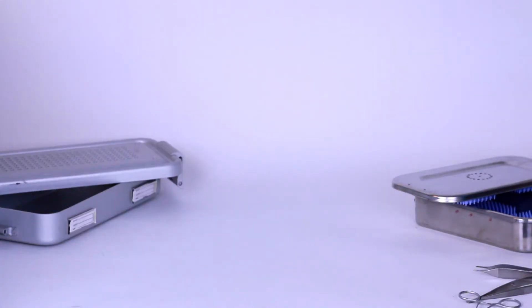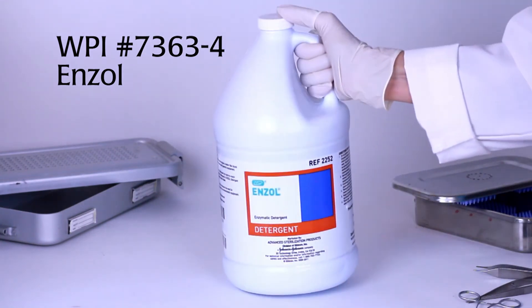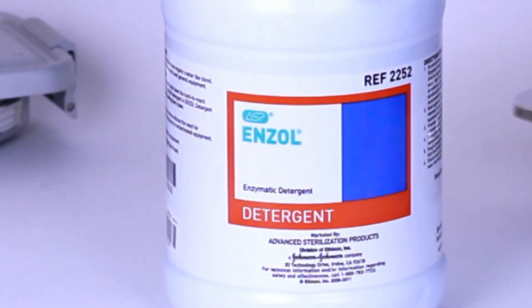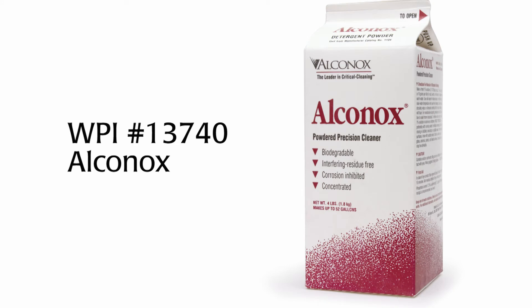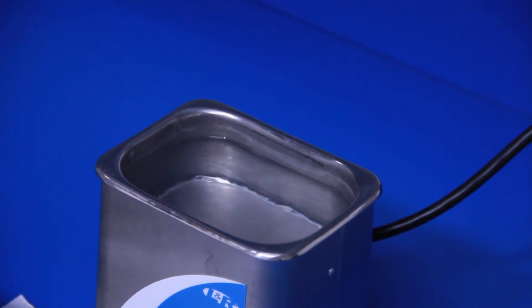Before you begin, fill the ultrasonic cleaner with deionized water and enzymatic cleaner like Enzol, according to the manufacturer's recommendation. You may also use a neutral pH or mild alkaline detergent like Alconox. Run the cleaner for several minutes to allow the temperature to equilibrate and to remove any gases from the solution.